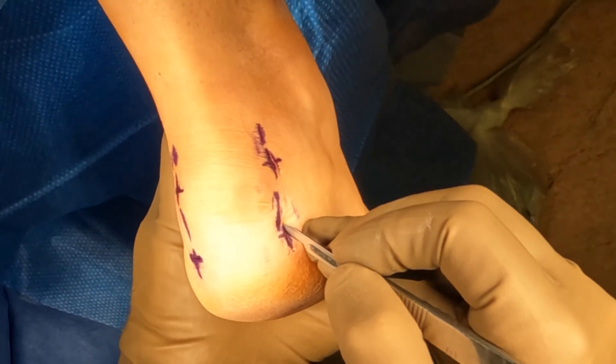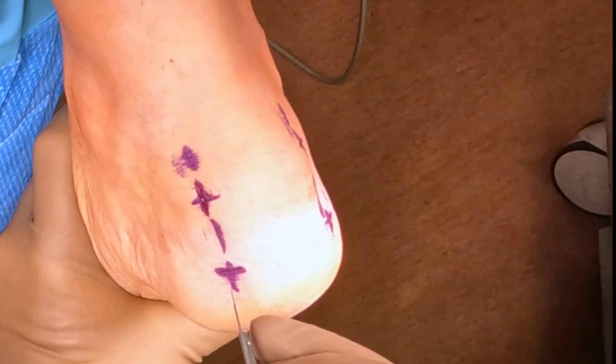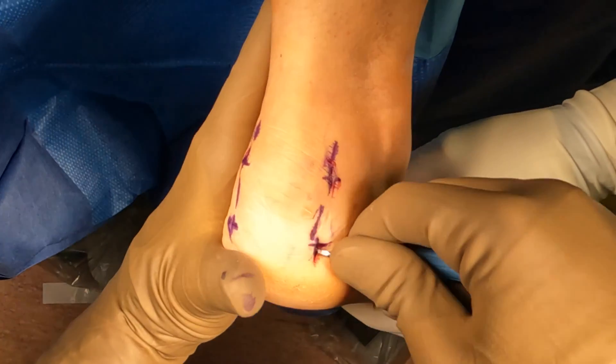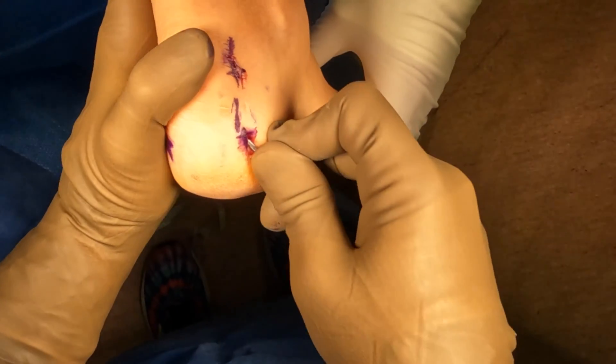So what we're basically doing is removing the large portion of the back of the person's heel through four tiny incisions to reduce their pain. This is very common. Patients will present with pain to the back of their heel, where they think it's Achilles tendinitis, but it's actually on the bone where the Achilles inserts into the heel.